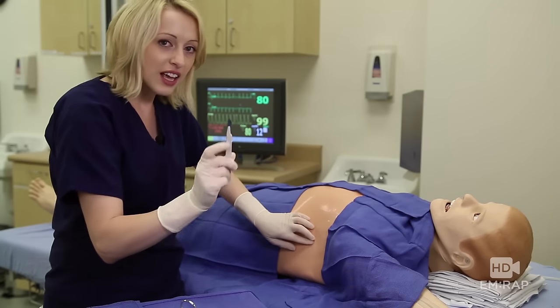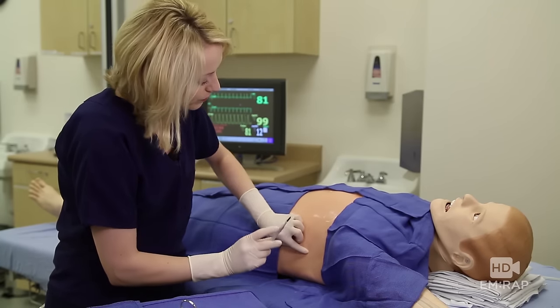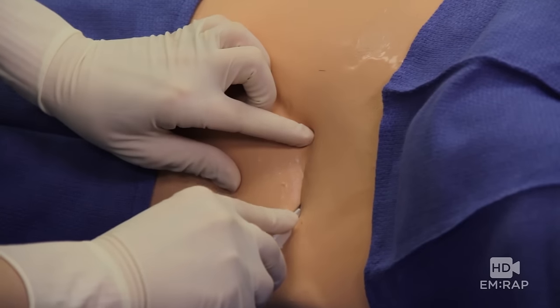Give that a minute to take effect and then make your skin incision. Take your 10 blade and make a nice long skin incision.